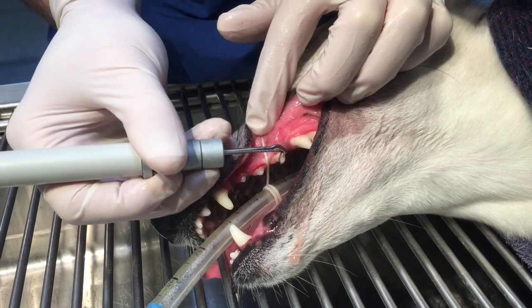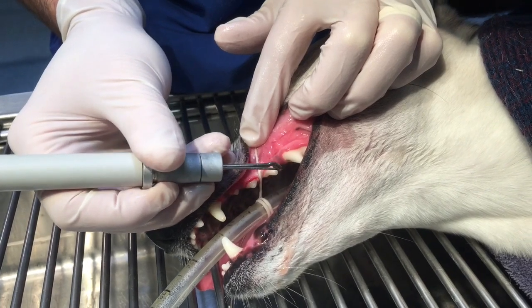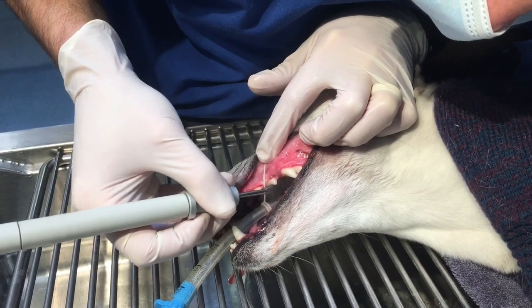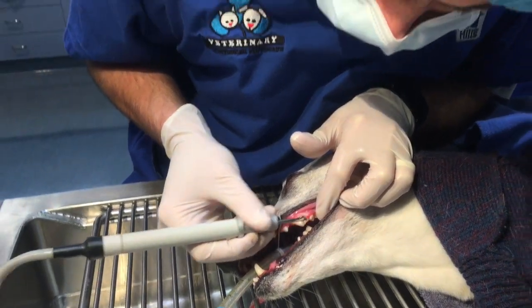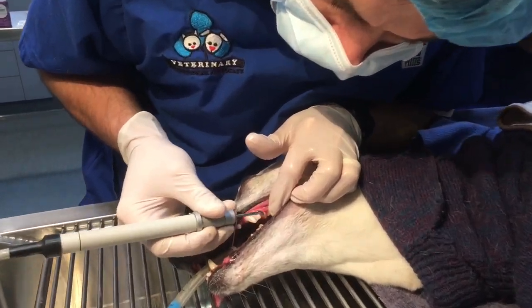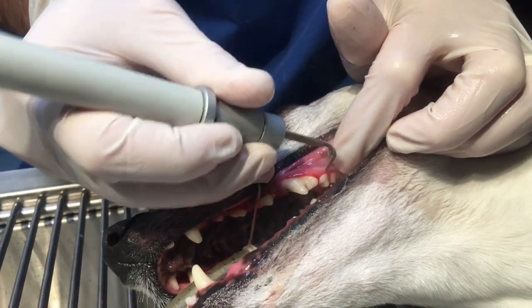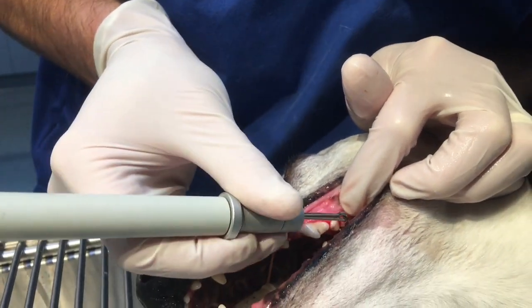You can see how that tartar sort of melts away in the face of the ultrasonic scaler. The other beeping you hear in the background is what's called the pulse oximeter. That checks the oxygenation of Rosie's blood and also her heart rate. We've always got a nurse monitoring all of their anaesthetics, and the machines that go ping help them to keep an eye on what's going on and alert them before there's too big a problem.